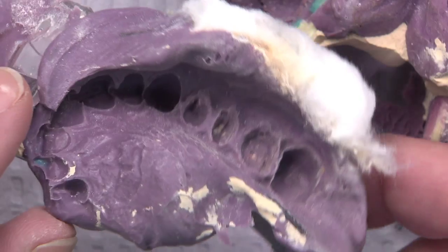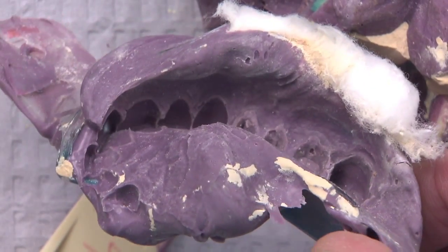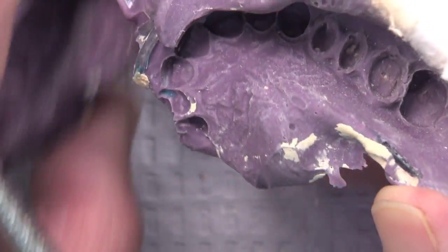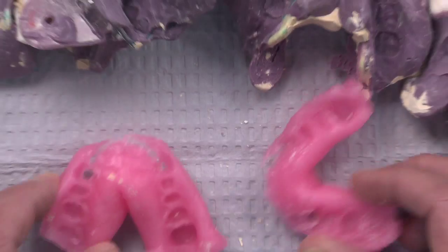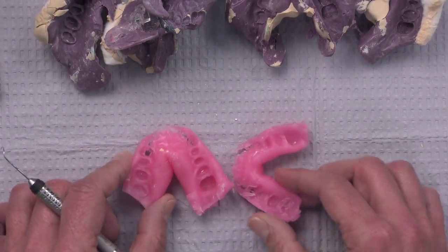But I still don't think you can generate enough pressure to really get it down there compared to that 2-cord technique. I've tried it. I've tried the different techniques, frankly looking for shortcuts, looking for an easier way to do it, and haven't seen them. So those are kind of the impressions, and 5 of them I know is super frustrating for that doctor to have to do. Also not a big fan of wax bites.